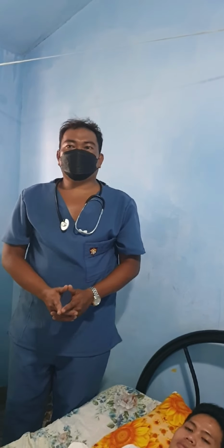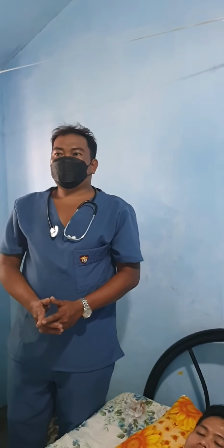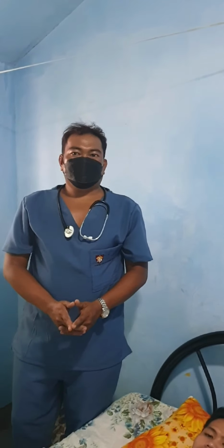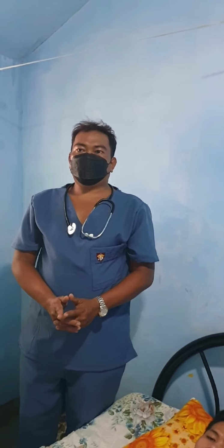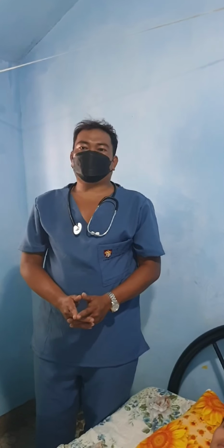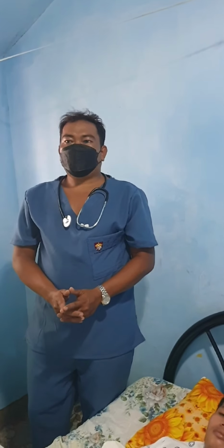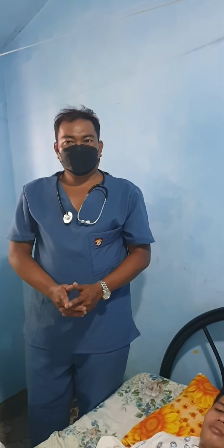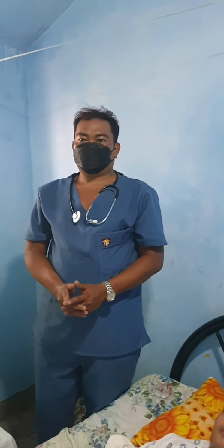Explain the process to the patient. Offer the analgesic, bathroom, etc. Listen and attend to patient's cues. Ensure the patient's privacy and dignity. Assist with the ABCs, airway, breathing, circulation, and oxygen safety. Apply the principle of asepsis and safety. Check the vital signs and complete necessary and focused assessment.